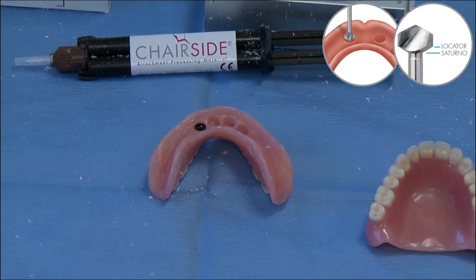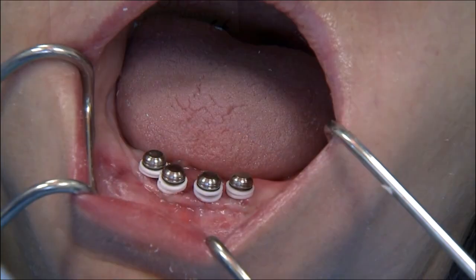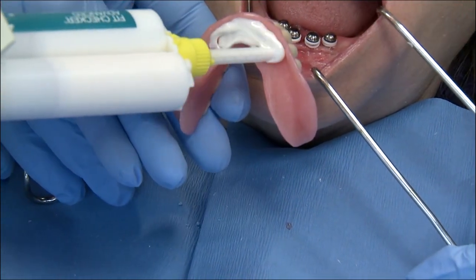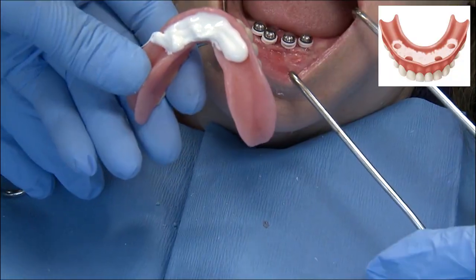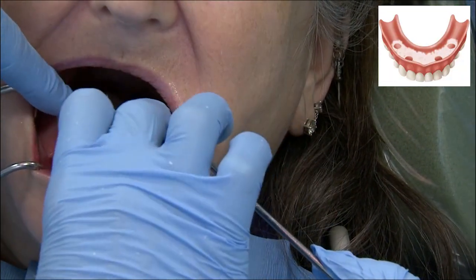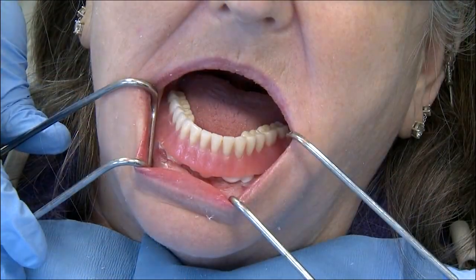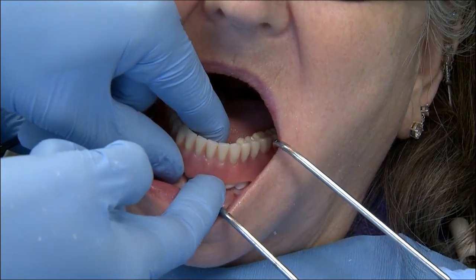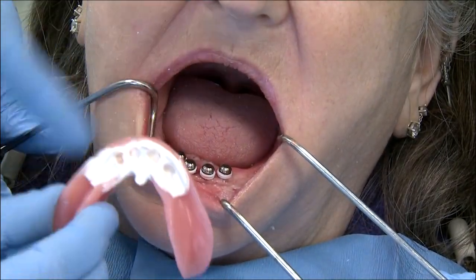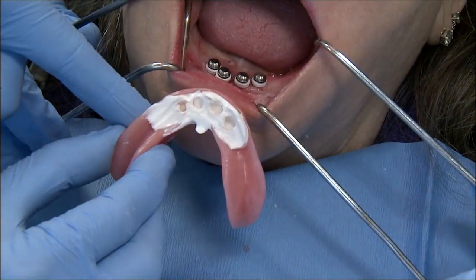As the locator denture cap is placed inside of the recesses, you can see how it's perfectly sized for a precise application. We've gone ahead and placed the four locator denture caps plus the block out spacers, and we're injecting a fit checking material into the intaglio surface of the complete denture in the area of the recess holes, then seating the denture into place to mark any areas of show-through. I like to hold this passively with my fingers, letting it set up completely, then removing it carefully. You'll notice it comes out pretty cleanly, and any areas where we see acrylic resin shining through are where we need to adjust still.